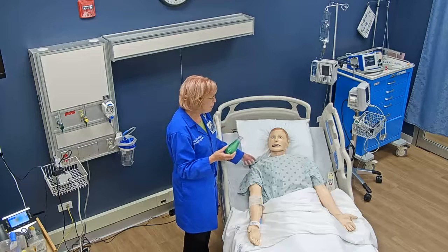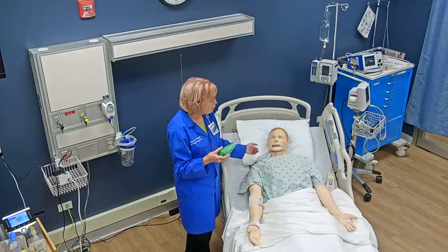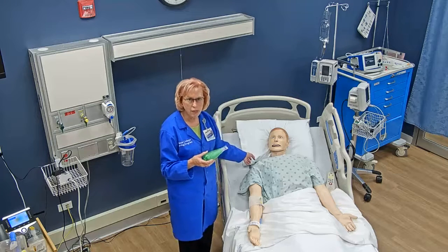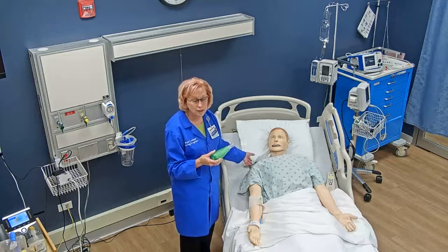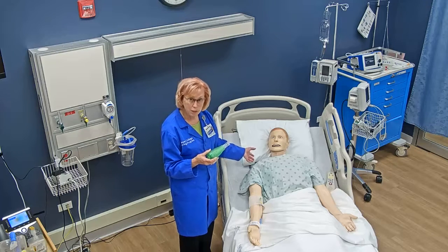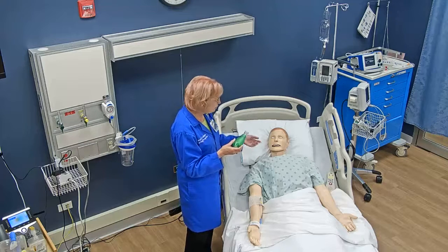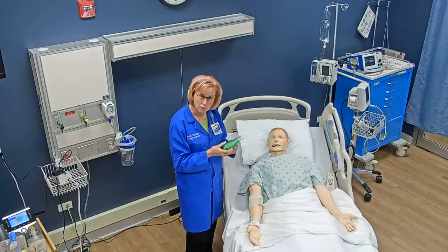I'm going to teach my patient how to use this device, and I'm first going to explain why he's using it. It's used often with patients who have retained secretions, like patients with COPD, pneumonia, or bronchitis. I explain to the patient that he'll use this to help loosen those secretions so they can be coughed out.